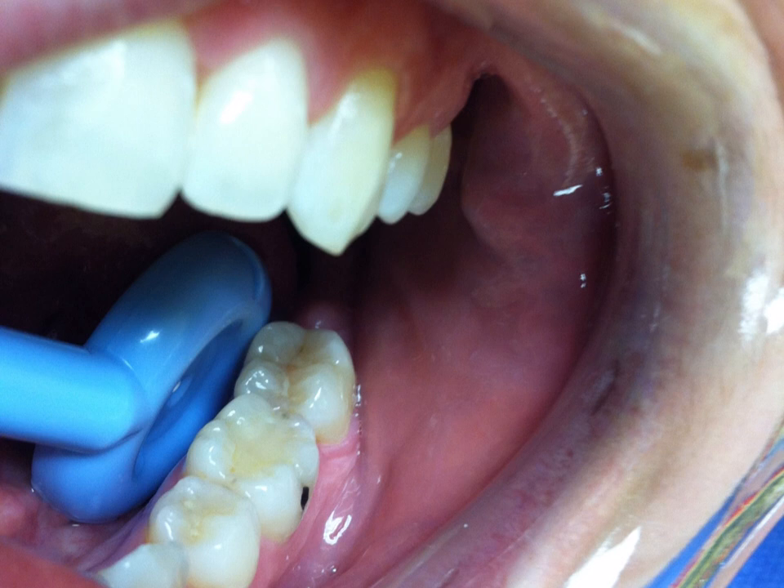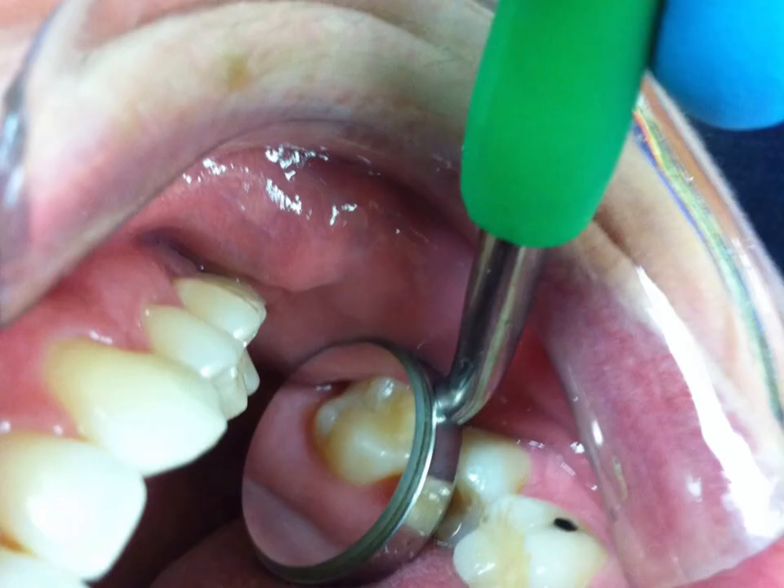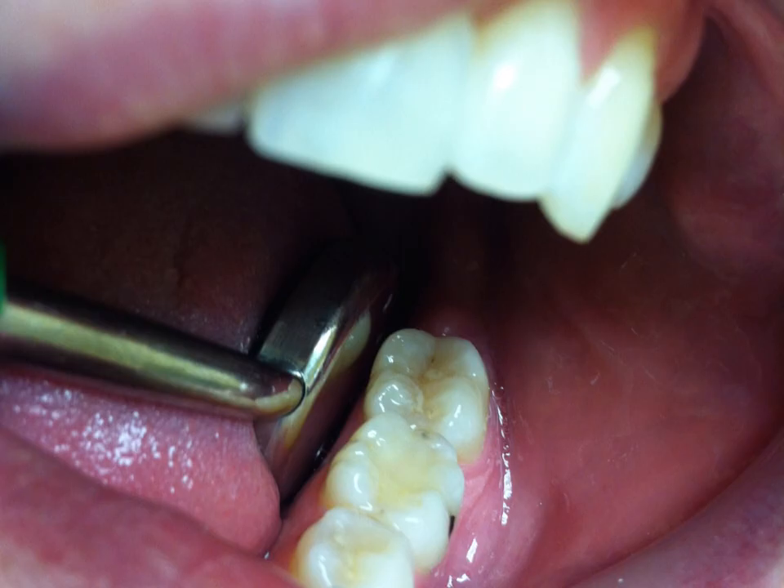This is the lower left molars again — where suction mirrors really work well when you're using the power scaler on the lingual side, especially going to the distal of the last molar. Here's the Diodent version in the same lower lingual position. The picture is a little blurry — I'm using my iPhone 4. Here it is at the upper left and lower left molars, and the Diodent works really well in this position.